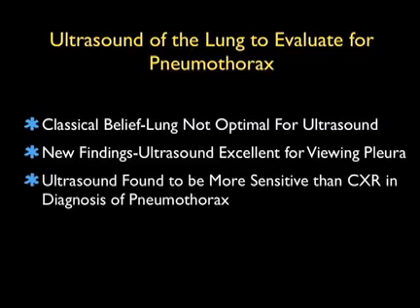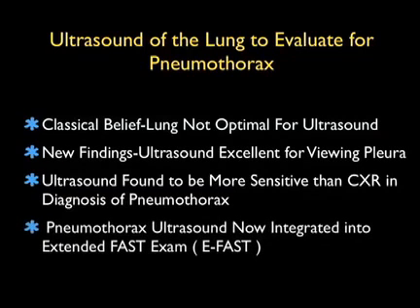There's been a lot of research looking at this, and what's interesting is that ultrasound has now been found to be more sensitive than chest x-ray in the diagnosis of pneumothorax, especially in the supine trauma patient. And now we're going to add on views of the lungs looking for pneumothorax as part of our extended FAST exam, or the eFAST exam, that we'll be performing in trauma patients. We can also detect pneumothoraces in our medical patients.